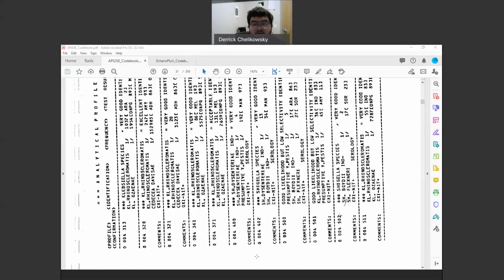Now, this is an example of, I paused it and I did some digging on my end. This is an example of properly writing down your code number. I didn't properly write down my code number. There was an extra 0. So it's actually 0004400, which is this right here, which is, in this case, Shigella dysenteriae or dysentery. Enteric bacteria. So now we know that we have a Shigella species or an E. coli species or Shigella dysenteriae.